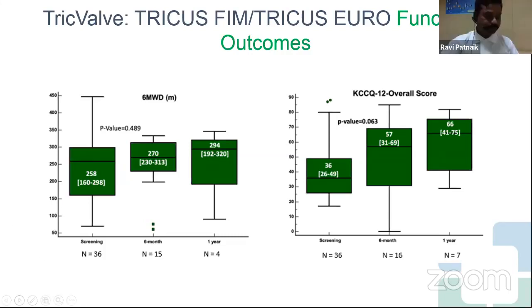Perfect. Thank you. As I was saying before, I'm not sure how much of the last slide you captured, but these functional outcome scores are incredibly important in terms of correlating with patient morbidity and mortality. And the FDA looked specifically at the KCCQ score, a delta of 10 to 15, as an important surrogate for patient well-being. And we're certainly seeing some of these results play out in the limited number of patients that have undergone 6 to 12-month follow-up.